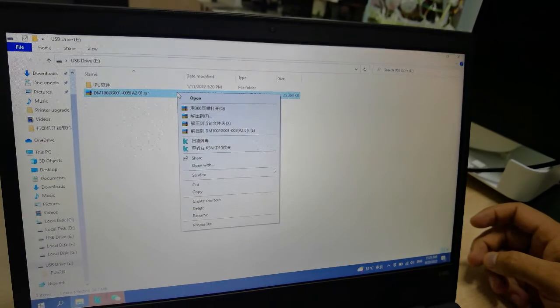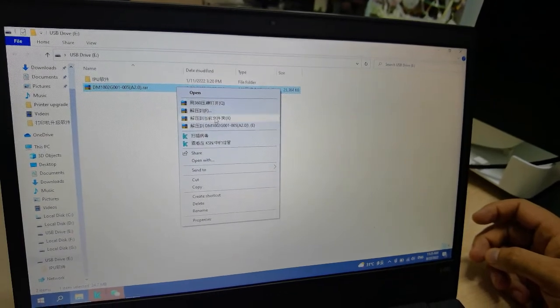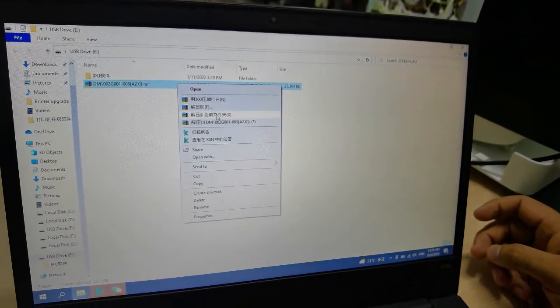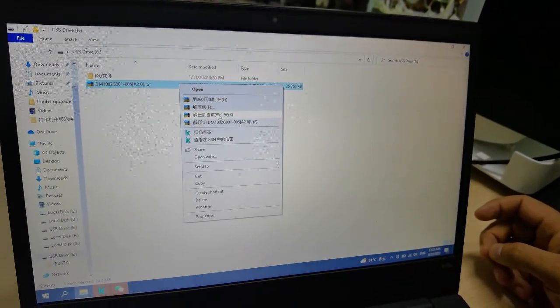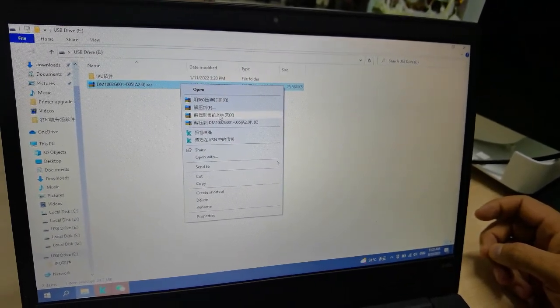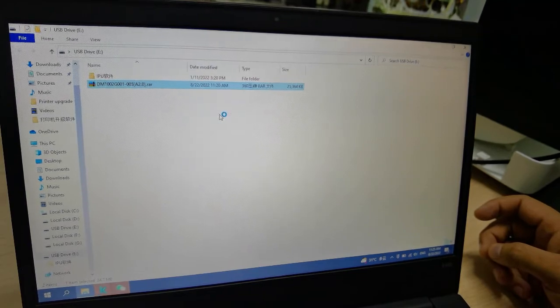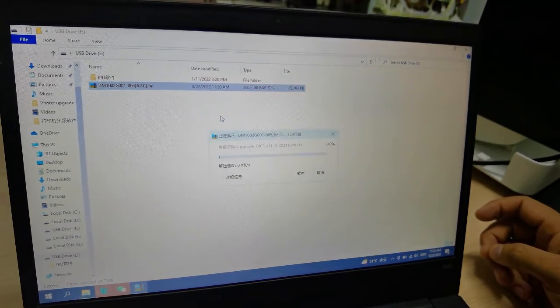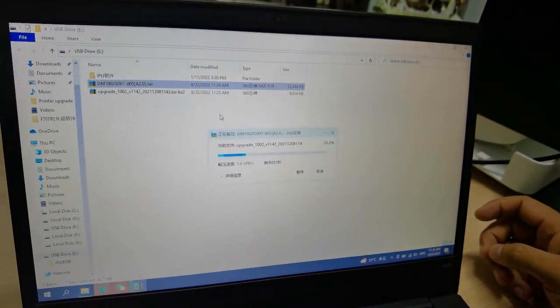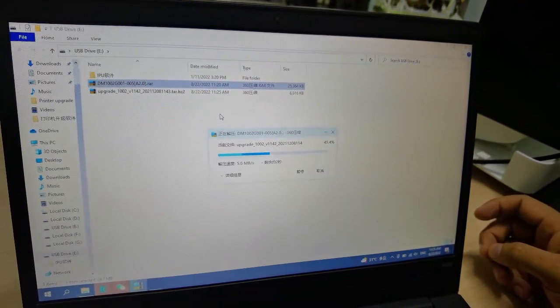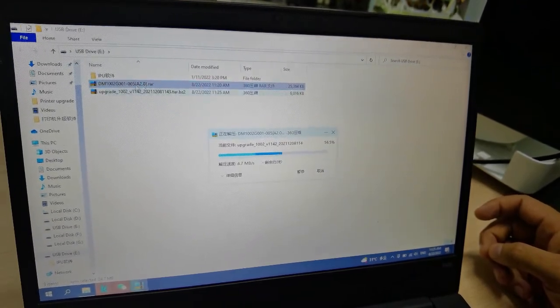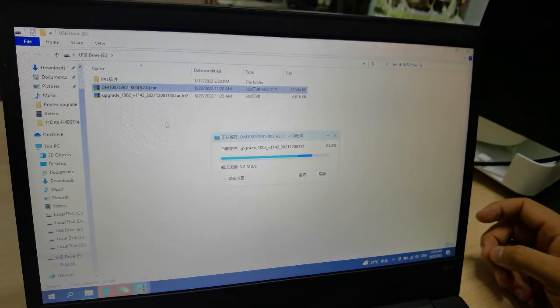Now I have to unzip it first. Right click on it. This one is in Chinese language, this means unzip. I unzip this folder. So now you can see this file is unzipped.